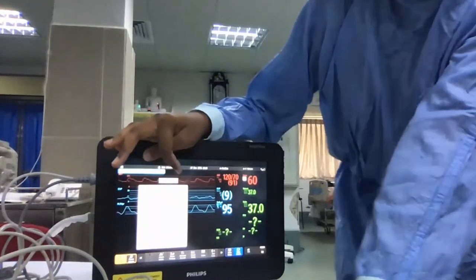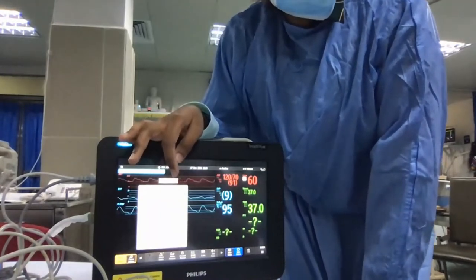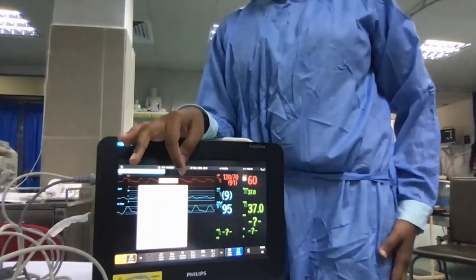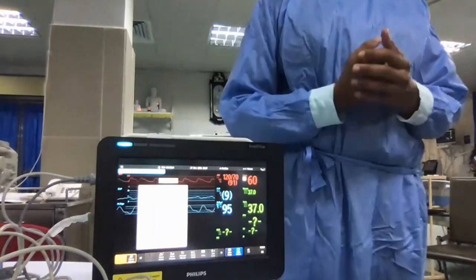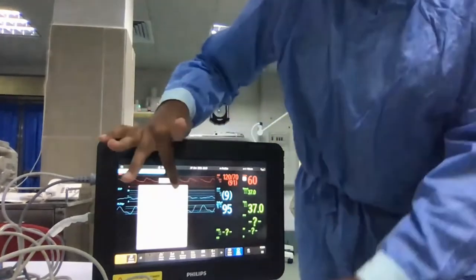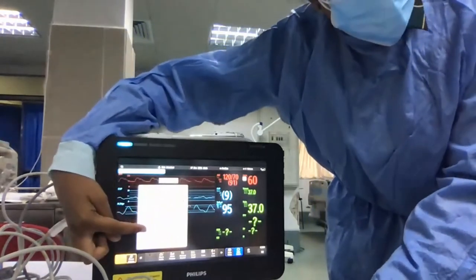Usually we use the right heart method, isn't it? Not the transpulmonary method, the one that we use with the central line. No matter, we use the transpulmonary, isn't it? Yes, because the right heart method includes a PA catheter, which is a highly invasive process. So PiCCO is transpulmonary. Okay, so this is transpulmonary. Then scroll down and you can see cardiac output.